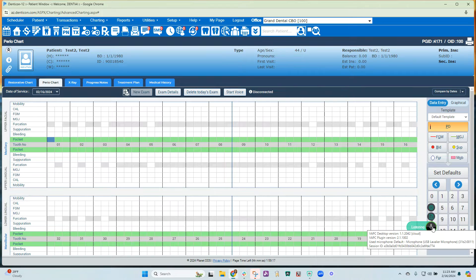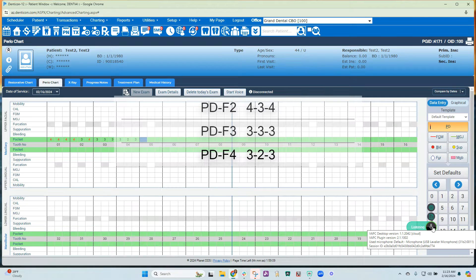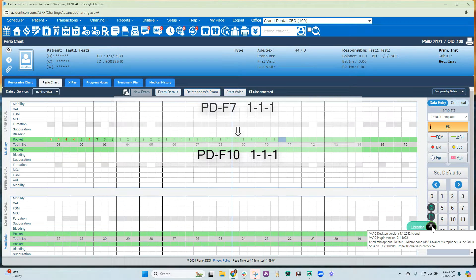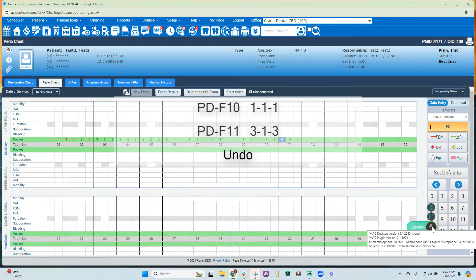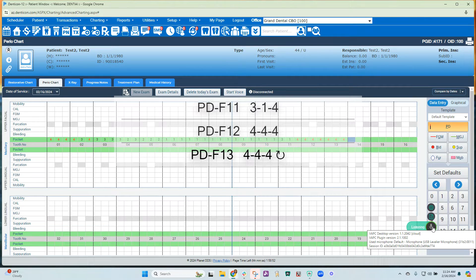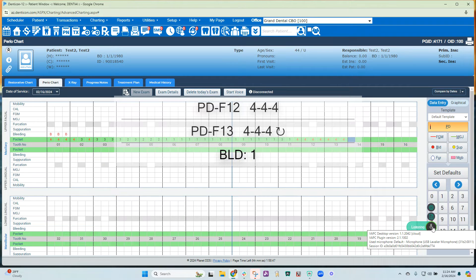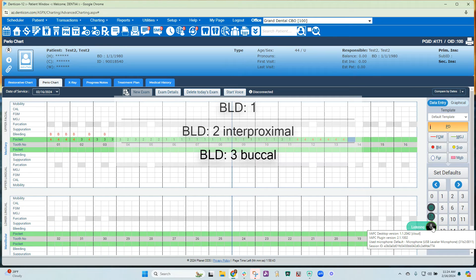4 4 4 4 3 4 3 3 3 2 3 2 2 2 1 1 repeat 4 3 1 3 Undo 3 1 4 4 4 4 repeat. Bleeding 1, Bleeding 2, Interproximal Bleeding 3, Buccal Suppuration 2 Buccal.